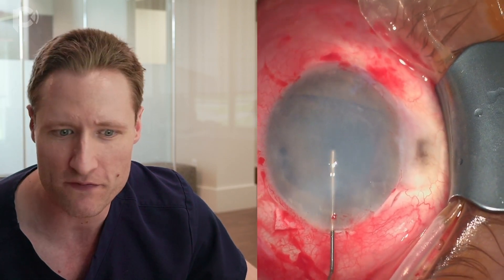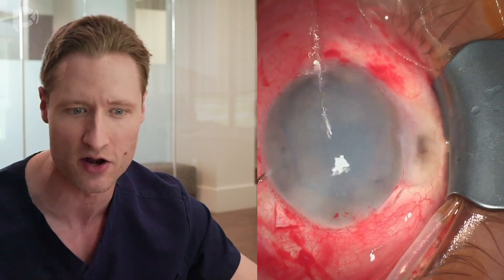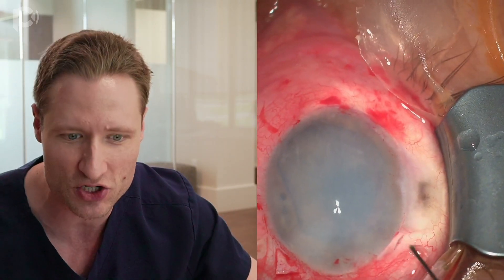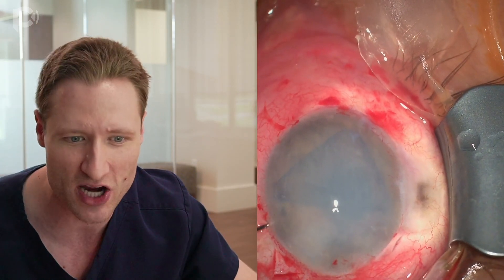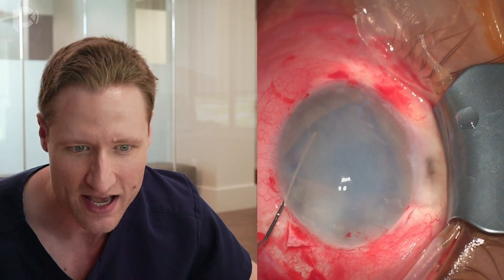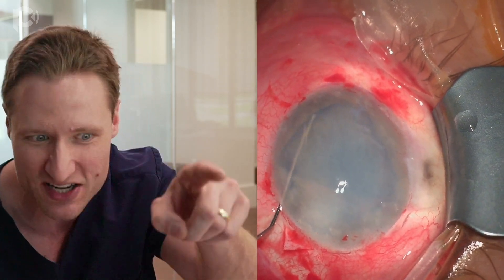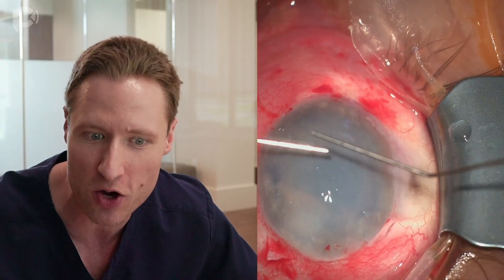If you put the graft in upside down, of course you get zero credit — it doesn't work at all if the graft is not right side up. I'm checking the Mozzaro sign again and still can't tell. I have no choice but to deepen the chamber and shuffle the deck. You just can't guess — you can't take a chance. I'm flipping and deepening the anterior chamber, and now the graft has good curled edges. I push into the edge of that curl — it's right side up; it embraces the cannula. Now I know the graft is right side up, and I'm positive I can finish unfolding.